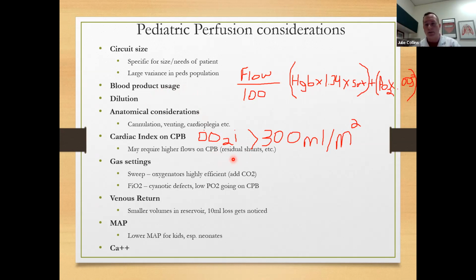Look at your blood gases, look at your lactates, look at your NIRS. If the rest of the picture looks pretty good, maybe this kid is tolerating a DO2 of 260 and metabolically looks okay. Not everything is always black and white when it comes to medicine. You try to use all the information at your disposal to really make good clinical decisions.